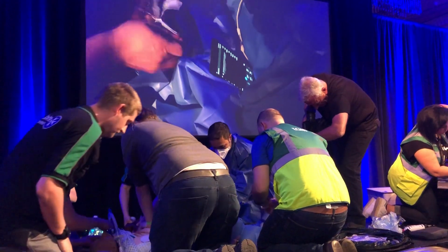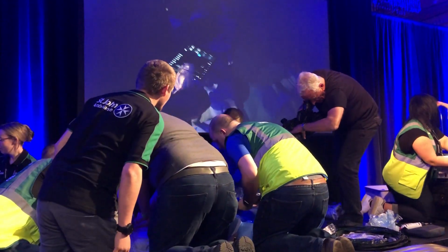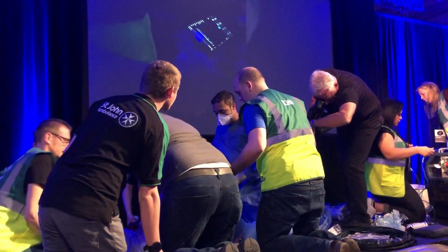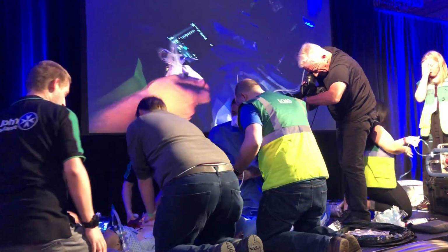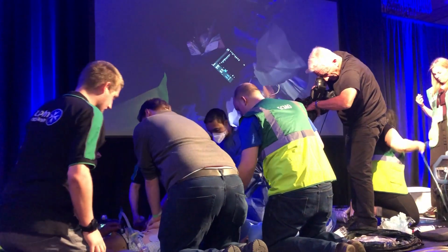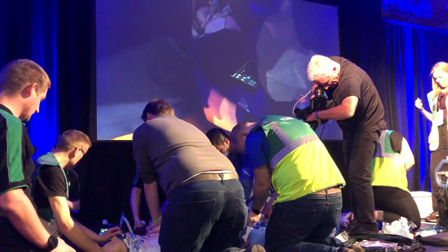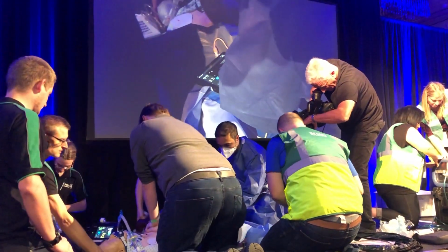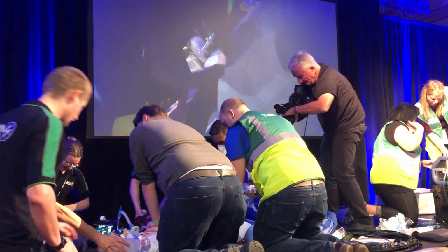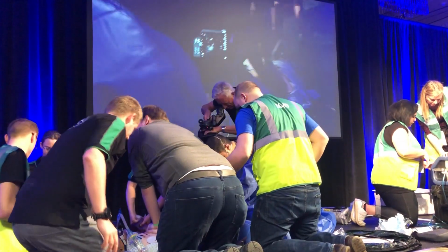During this time, he's completely task focused on the wires. He won't even know how old this patient is. He's not even starting to think about inclusion criteria. He's focused entirely on getting wires into vessels. And Rob, who's a facilitator, is his bandwidth. So he's the go-between between the advanced team and the ECMO team.